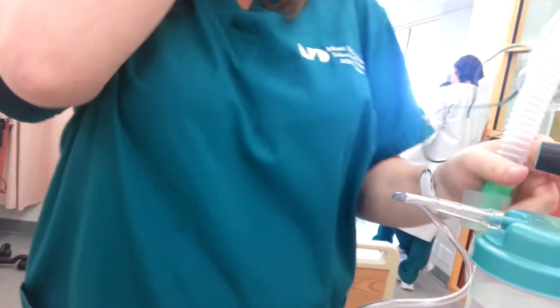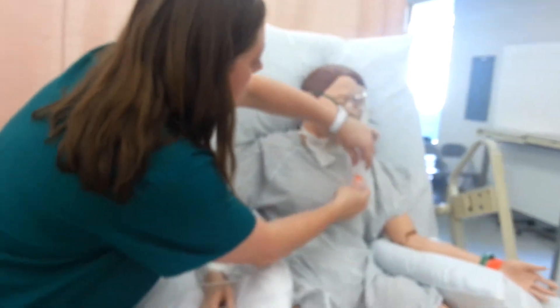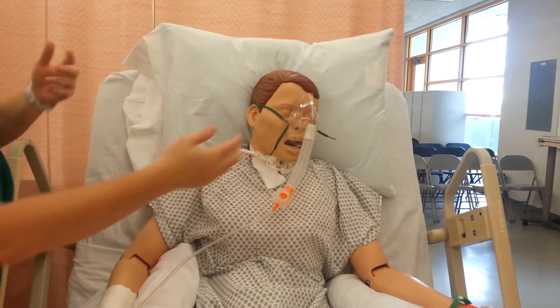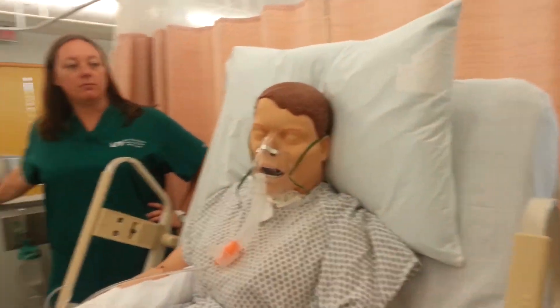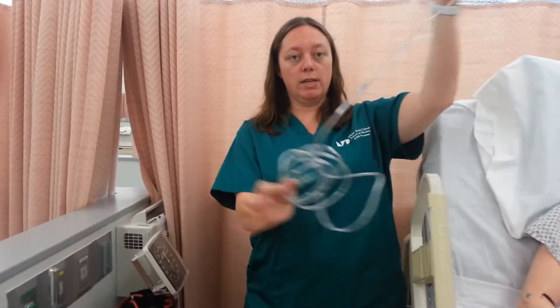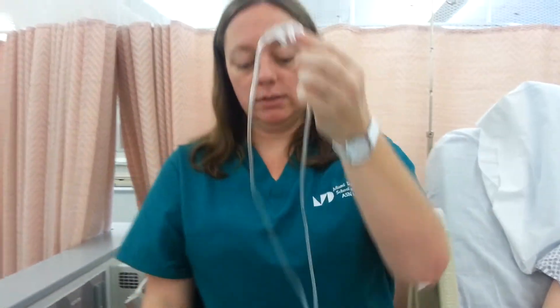I don't think this is the right tubing for this — maybe it is backwards, whatever. Then this part would go there, and the straps go over the ears. Of course you have the patient in high Fowler's. That is the Venturi mask.